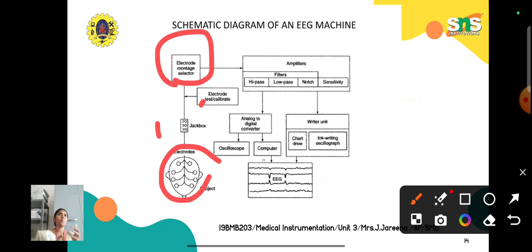In that case, it's better to go with the specific lobe, so we can avoid the confusion of other lobes and go very deep into that particular targeted area. For that reason we have the option of selecting any lobes based on the patient condition or physician interest. That is the reason to have that block.